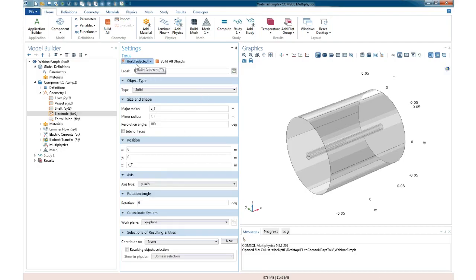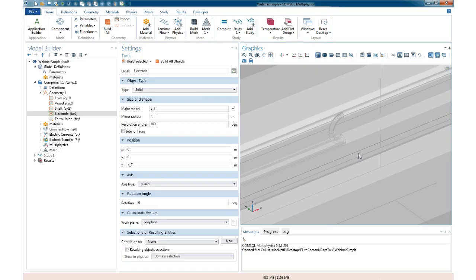And it looks like it did. So let's go in and take a look at what we just built. And it's backward, but that's fine. We can rotate it through 180 degrees. And yes, that worked. We are now actually almost done building the geometry of the system I'm going to simulate. I'm going to do a few more things almost as bookkeeping.